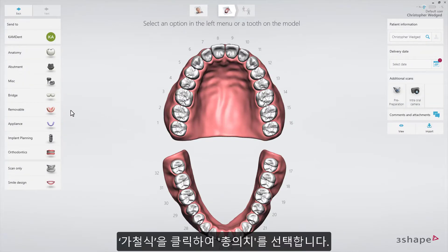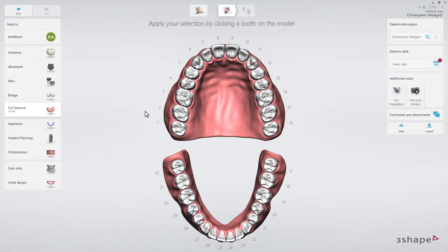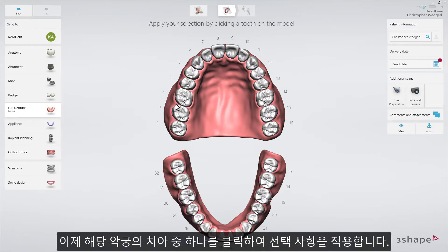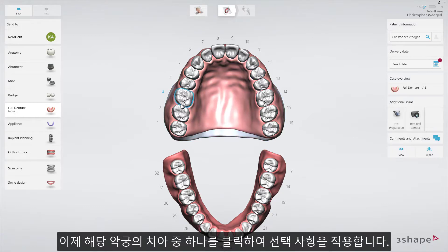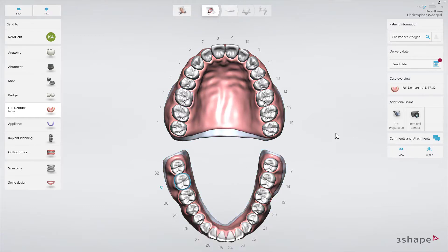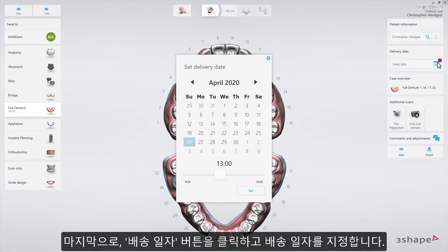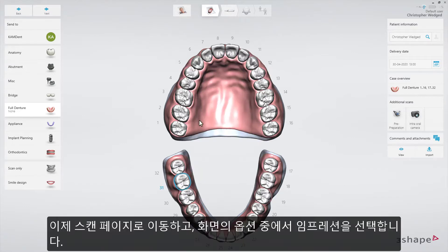Click on the removable drop-down list to select Full Denture. Now click on any tooth on the chosen jaw to apply your selection. Do the same for the opposite jaw. Finally, set the delivery date by clicking the Delivery Date button.